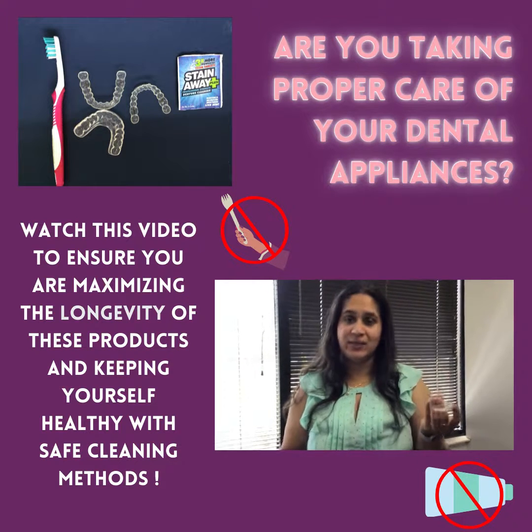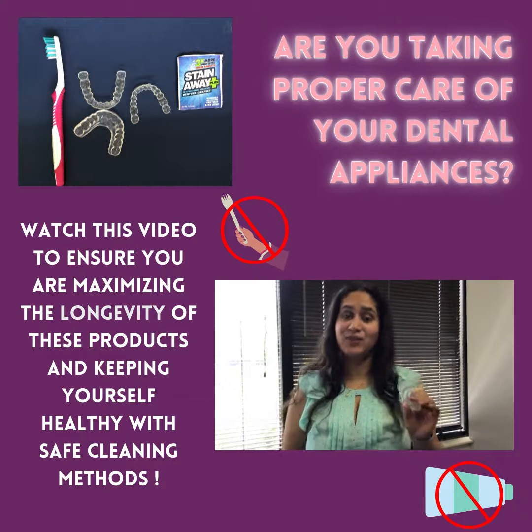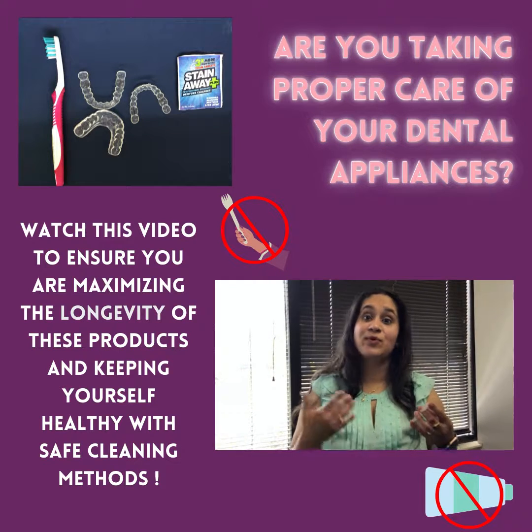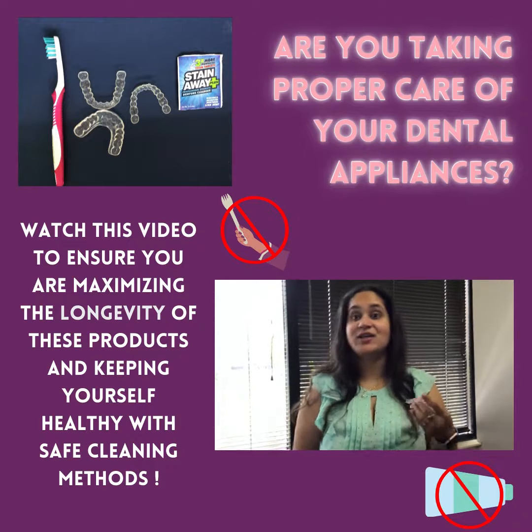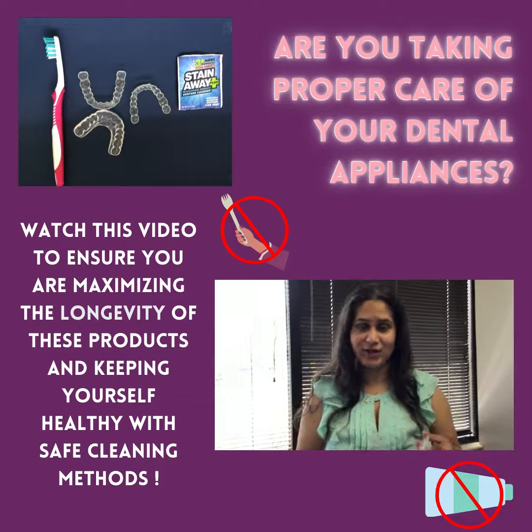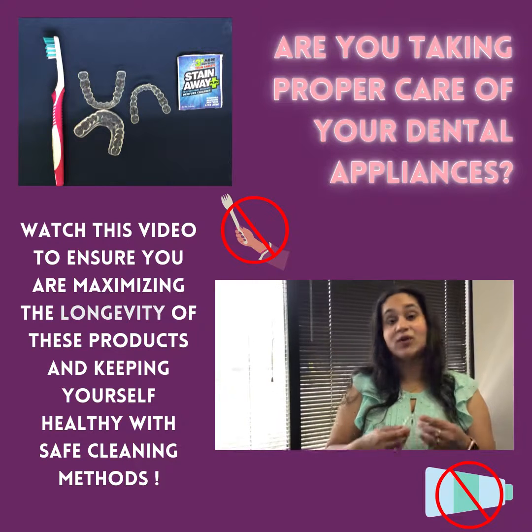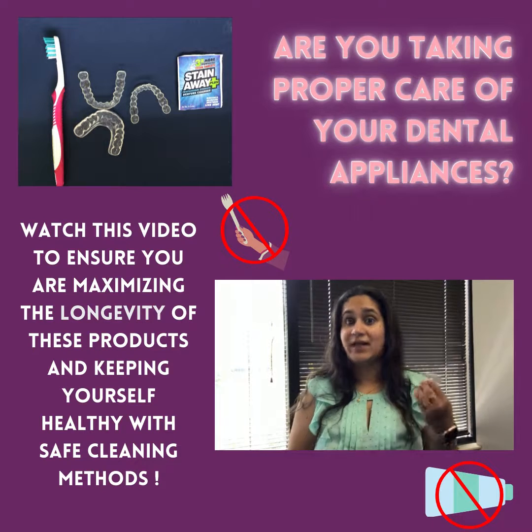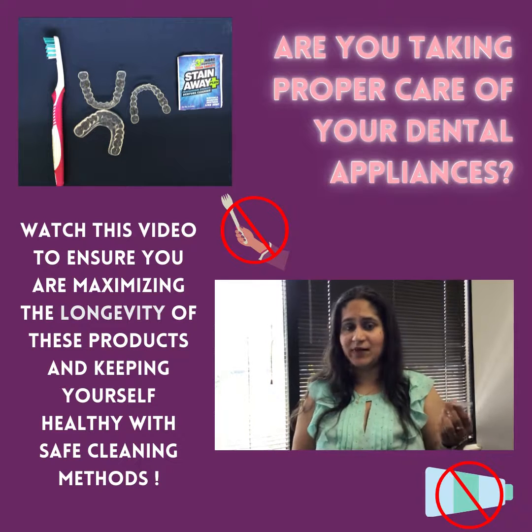How clean we keep the appliance is very critical, and the process we follow is equally critical. If we don't maintain it properly, it increases the porosity of the appliance over time, which can lead to more bacterial buildup — which is very unhealthy and unhygienic when we put it in our mouth. It can also determine how long your appliance lasts, as poor upkeep obviously shortens its lifespan.